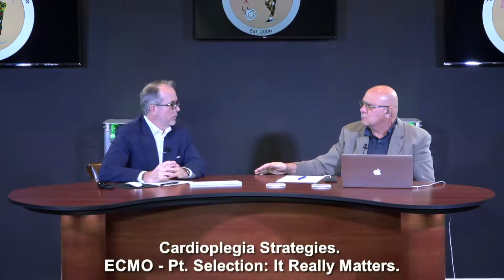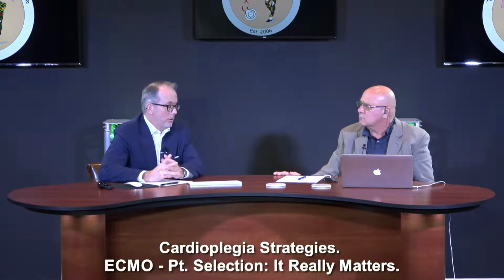Yeah, so that was something that we did some years ago. We were doing all warm, staying at 37 degrees, 36.5, 37, and all of our cardioplegia was warm. You can protect the heart with warm, continuous retrograde cardioplegia. I mean, you can protect the heart.